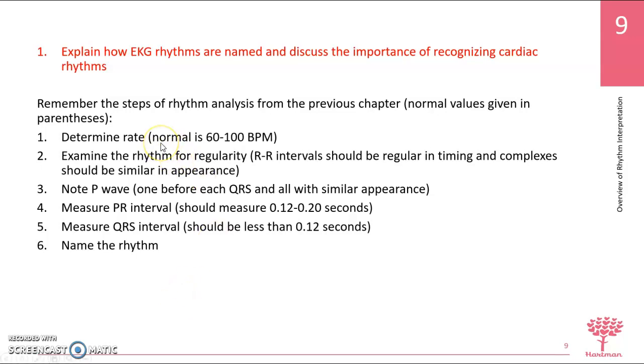So remember the steps on analyzing the rhythm of an EKG. You did this when we did the last section, and you should have gone through some of those exercises and learned how to look at the different rhythms and understand them and break them down.